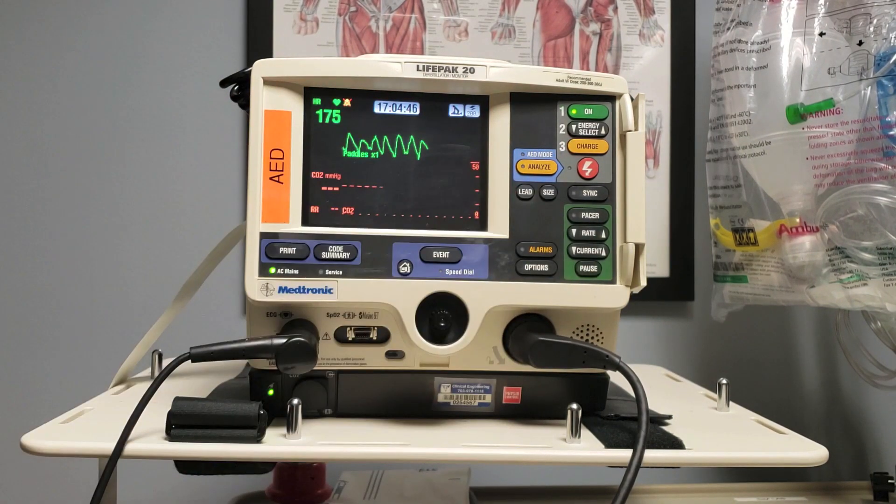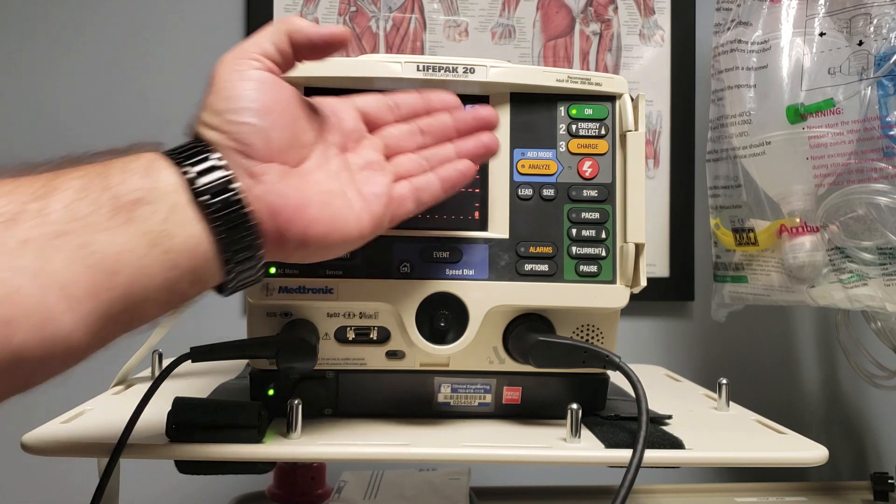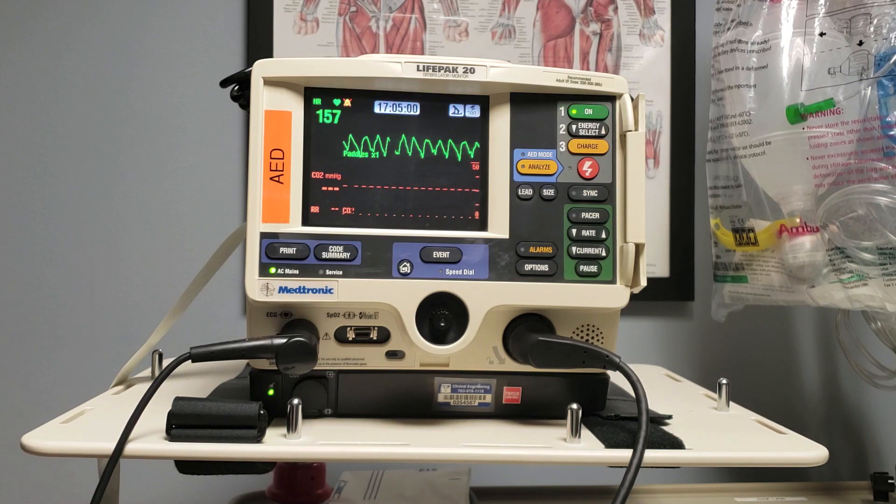Hopefully, in this case, we will have broken that VTAC and see something more resembling a sinus rhythm. If not, depending on the other ACLS providers, you may again shock at 200 joules, or you may decide to change energy. You can go up in energy with subsequent shocks, but you should never go down.